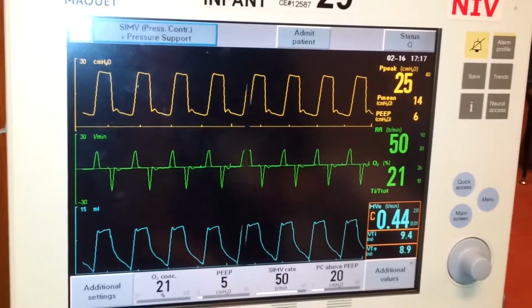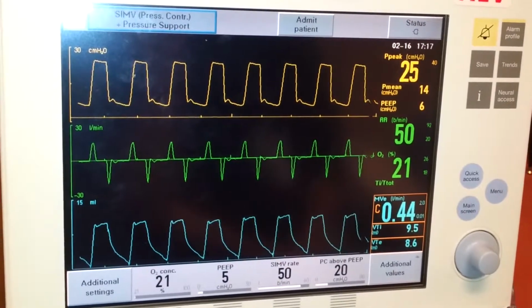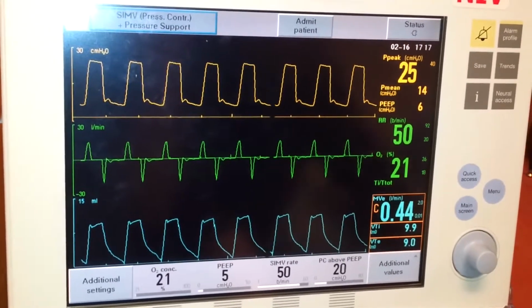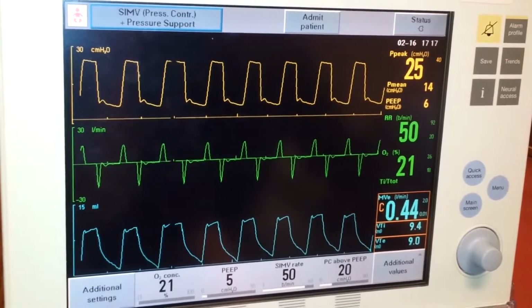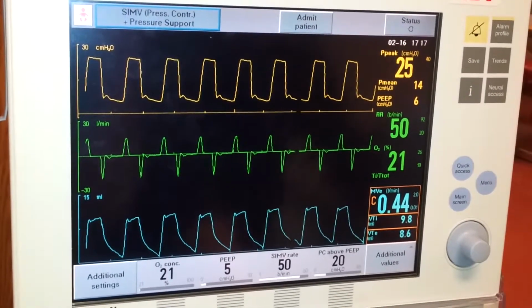Something really important to take in is at the end of the pre-use check, you always make sure to turn the tubing compensation on. Once you initially turn it on, it can be turned off and on later at any point. The only time you would turn tubing compensation off would be extremely low birth weight babies, so very premature babies. So we're going to go over why.